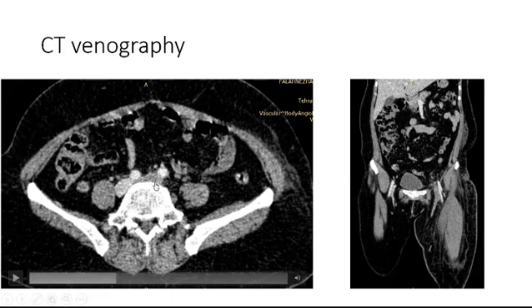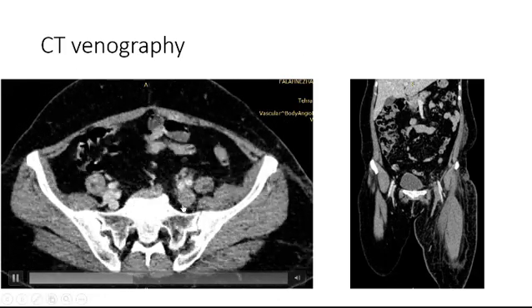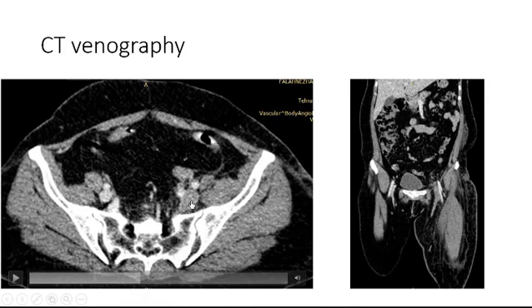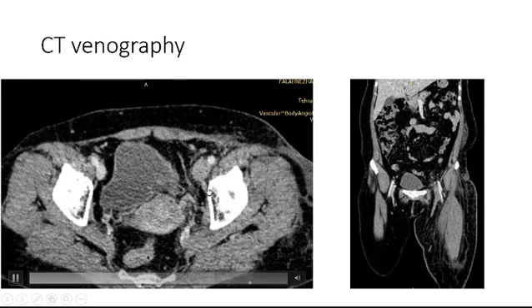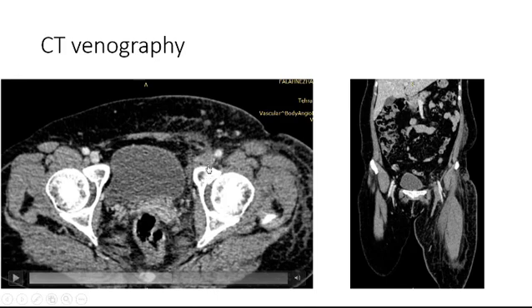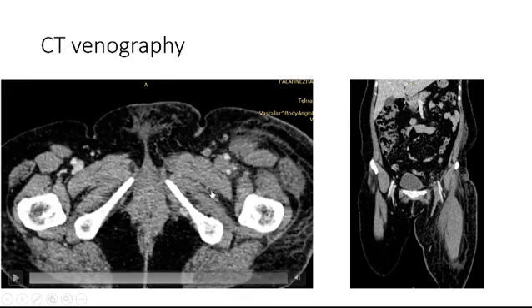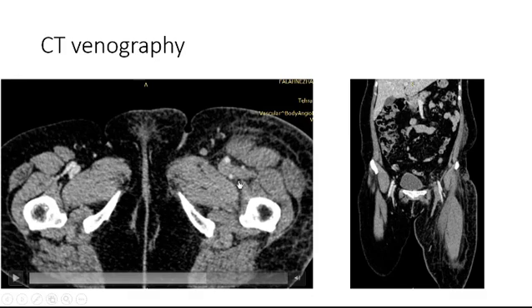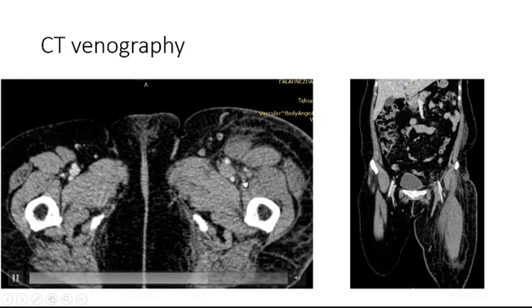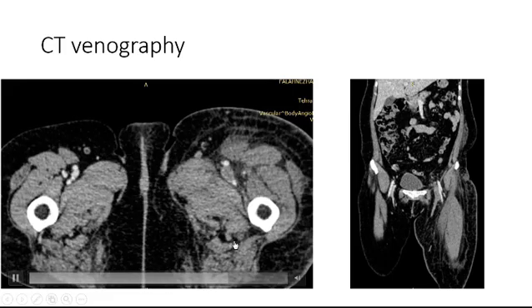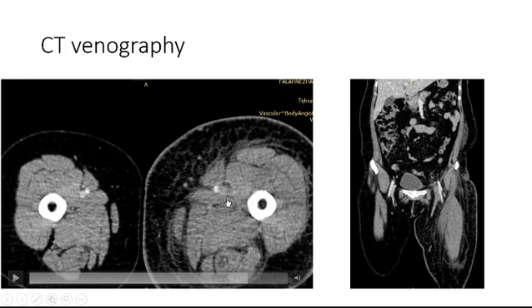Here you can see the occluded left common iliofemoral vein, and again the enlarged occluded left common iliofemoral vein with patent right common iliofemoral vein. Also visible: occluded left common femoral vein, occluded superficial saphenous vein, thrombotic occlusion of the left deep femoral vein, and occluded left superficial femoral vein.